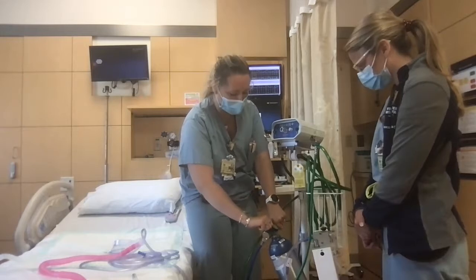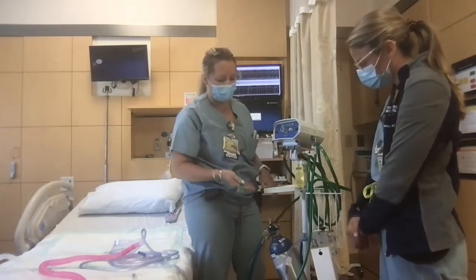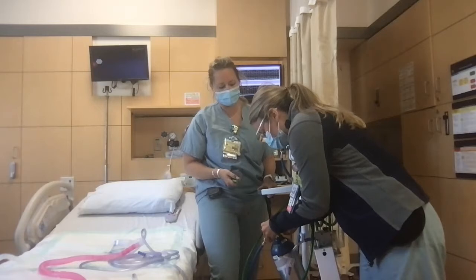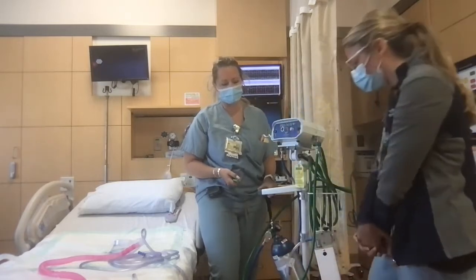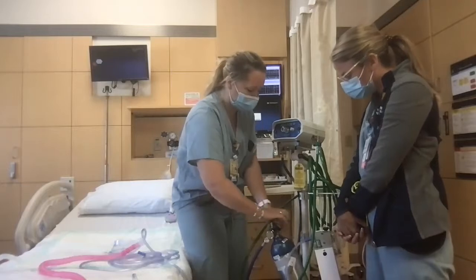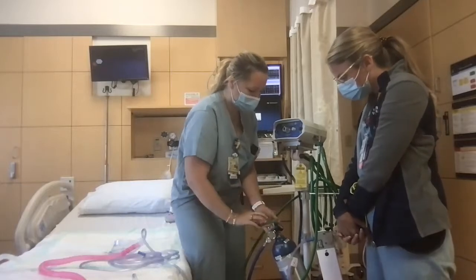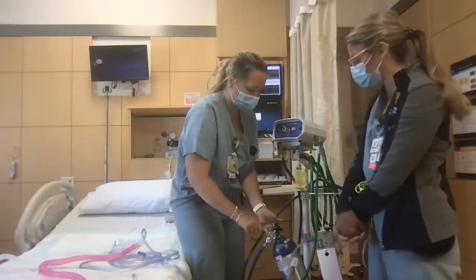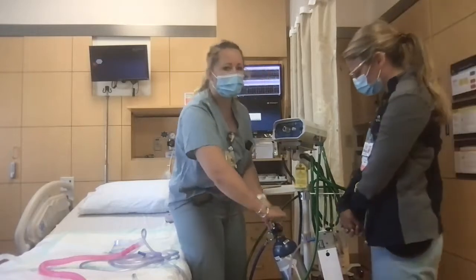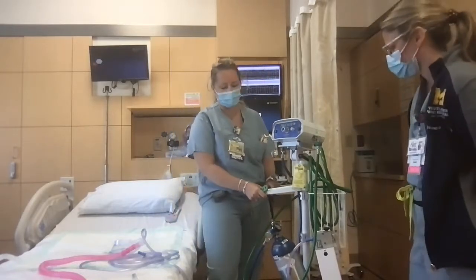So I'll take the key and go to the right. It's off. I'm checking that the prongs are well aligned to make sure that it's got a good seal. It looks good, so we'll go ahead and open the tank and listen for any audible leaking. We don't hear any leaking, so we can tell it has a good seal and it's now safe to be set up in the patient's room. I'll turn it back off and go to the patient's room.